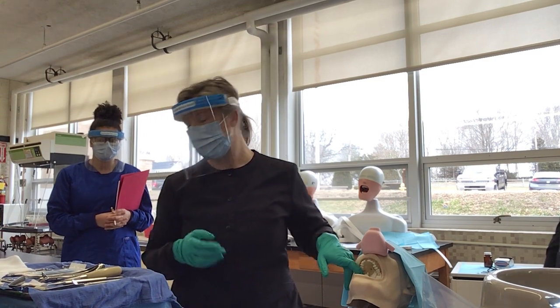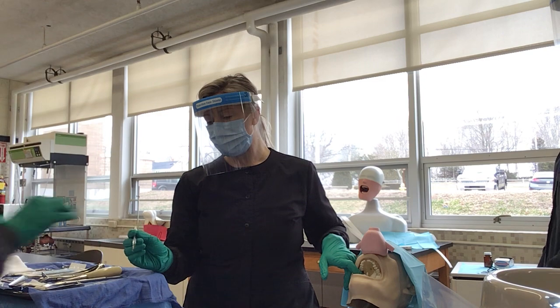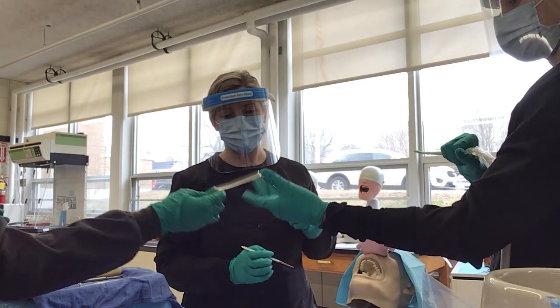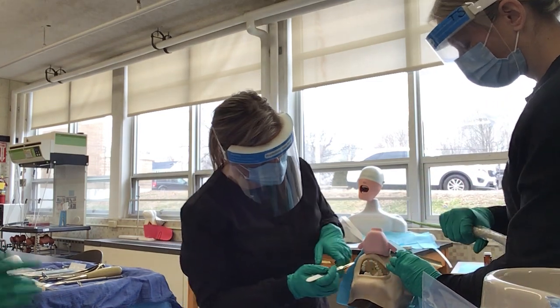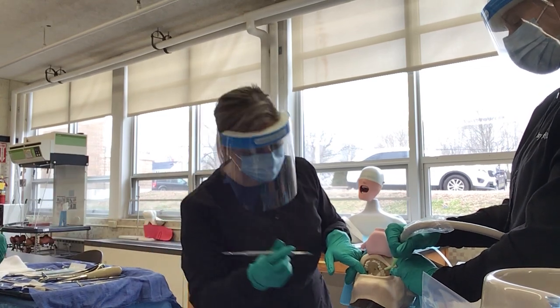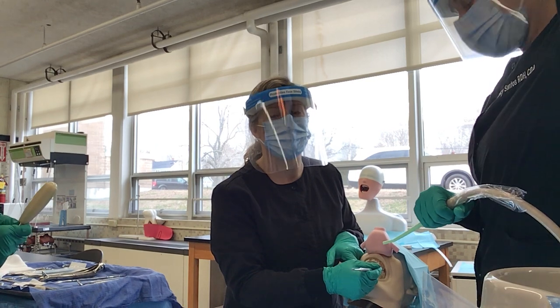Okay? And then I will take the scalpel blade. I want to come around here so you can see. So I'm going to take the scalpel. And if you could pass our tray assistant the extractor, please. So I'm going to make an incision. I'll take the periosteal elevator, number 2. So now I'm going to remove that periosteum from the bone. I think the light might mess up.